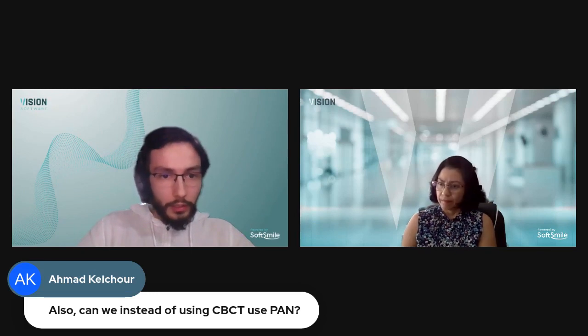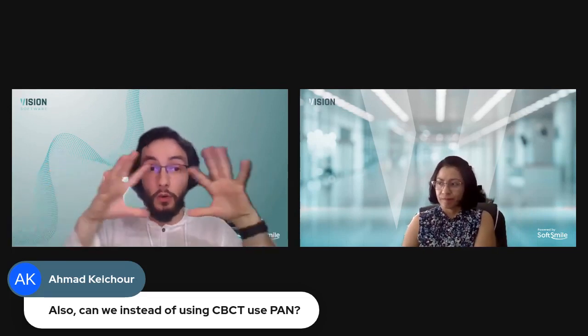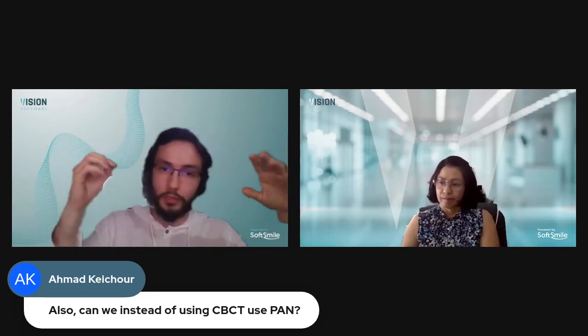So, can PAN be used instead of CBCT? I think PAN is panoramic. We do have the option to upload the JPEG of the panoramic, but that part is purely for visual identification. So you can use PAN as a reference, but the PAN is lacking the volume, right? It's lacking the volumetric information for us to extract the roots as a 3D object.